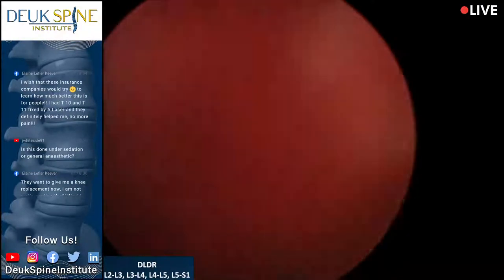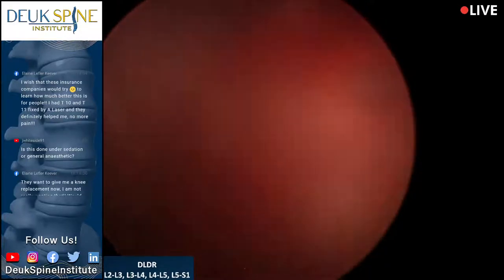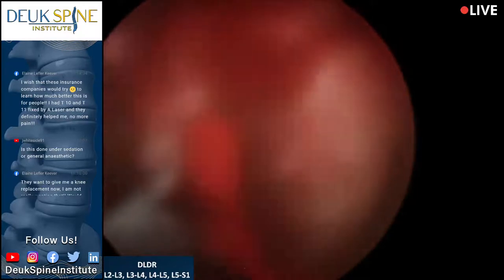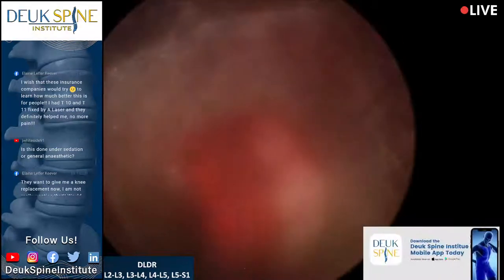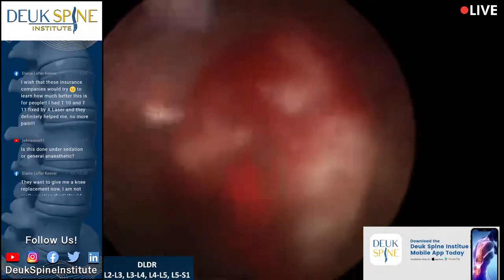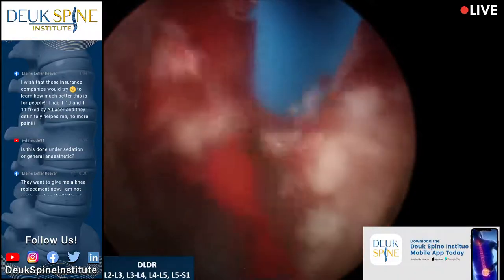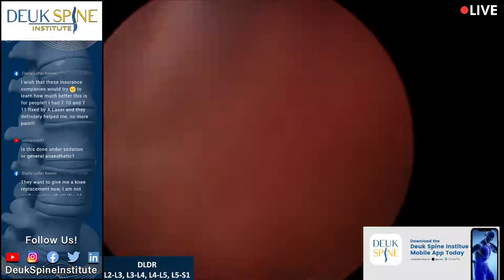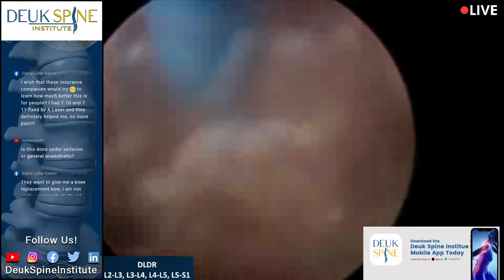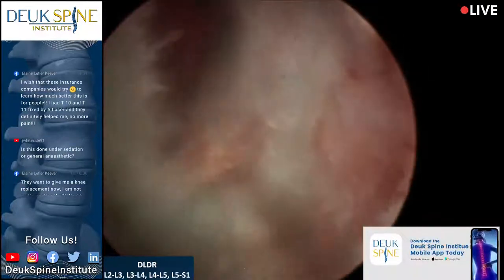Let's get the laser. Well, hold on. Let me find the corner. So what you're seeing there is a little bit of degenerated disc left in the disc space, and that's attached to the end plate of S1. And this is all inflamed. Look at how pink it is, red it is. Some of it's blood clot, but a lot of it is inflammatory tissue from the inflammation.